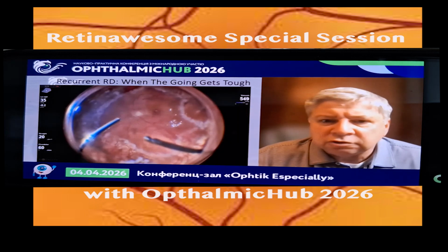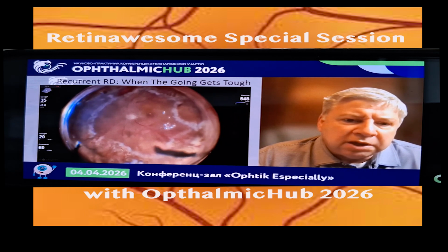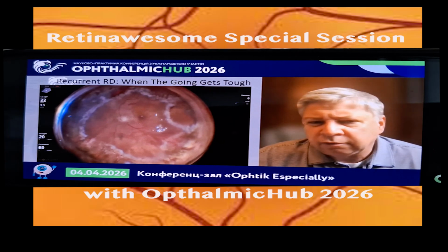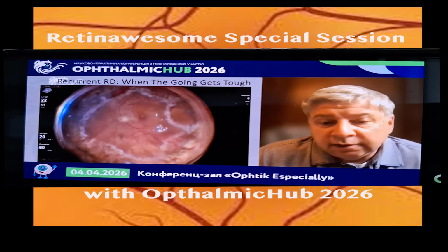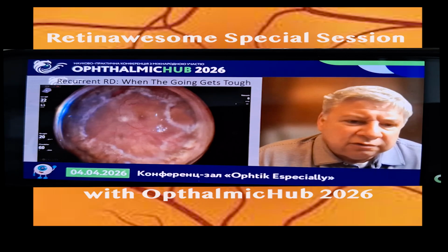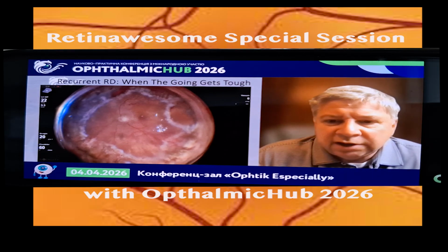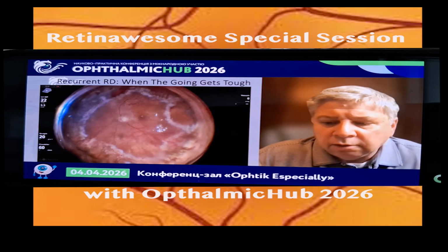I watched Kourous Rezaei present this, where rather than making a big retinectomy, you can make a few retinotomies. If the retina is only a little foreshortened, the retina flattened nicely. This patient is 2.5 months out. They went from bare light perception to 20/800, so they're doing well.